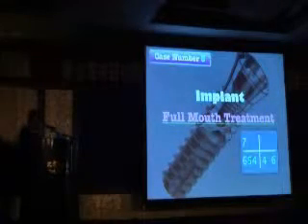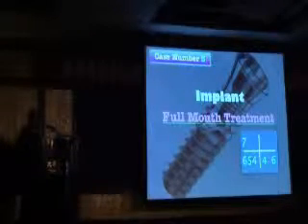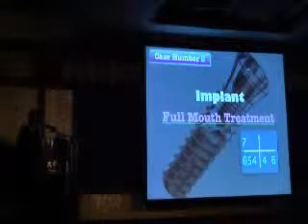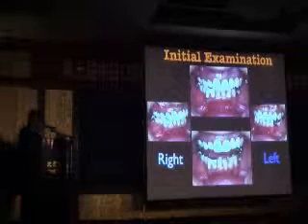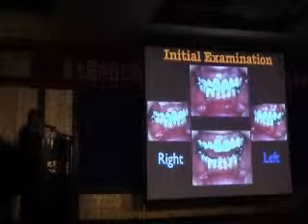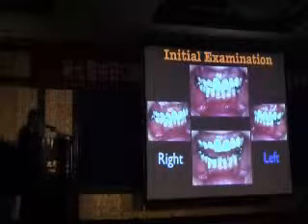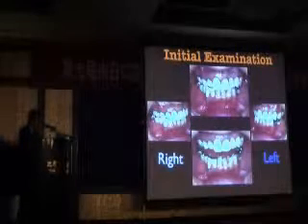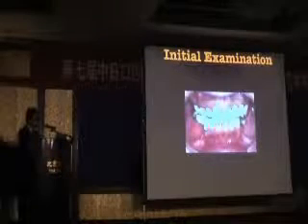In our third case, 5 implants in the mandible and 1 implant in the maxilla were used. In this case, I would like to share with you regarding 2 implants. This photograph was taken in the first consultation. The patient had unstable occlusion and could not bite her food. Aesthetic dissatisfaction was also a chief complaint.